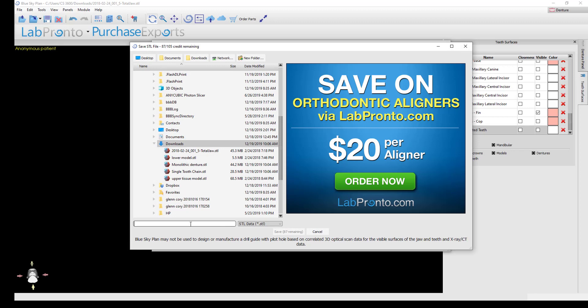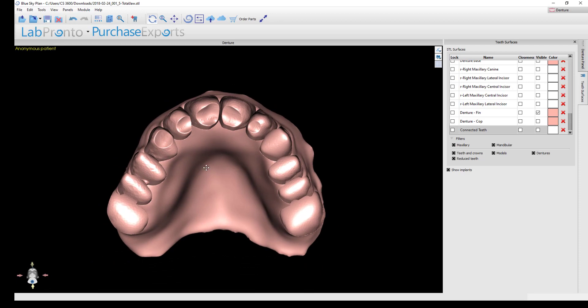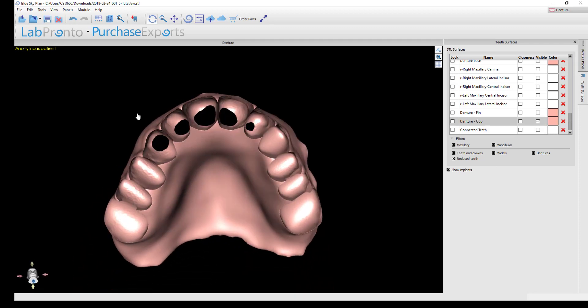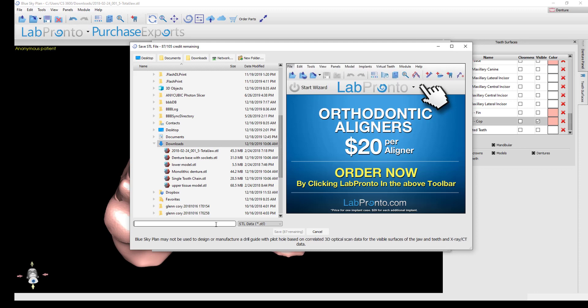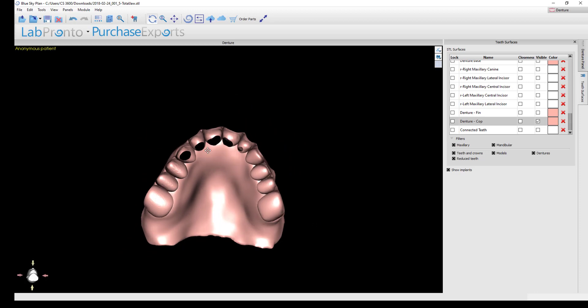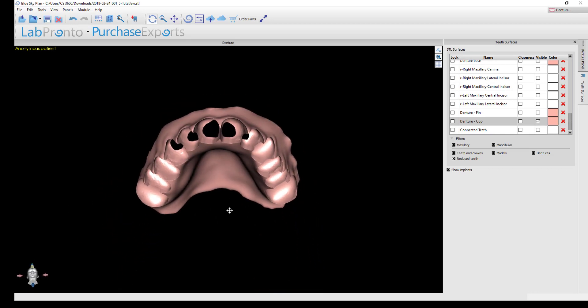Then turn on the denture-fin — the final trimmed base — and export it by itself. No deduction warning appears. I'll label this 'denture base with sockets.' Finally, you can also export the denture tooth reduction coping, labeled 'reduction coping.' I'd suggest exporting all of these files — it doesn't cost anything extra and takes just seconds, but gives you the flexibility to print monolithic or two-piece dentures in the future.